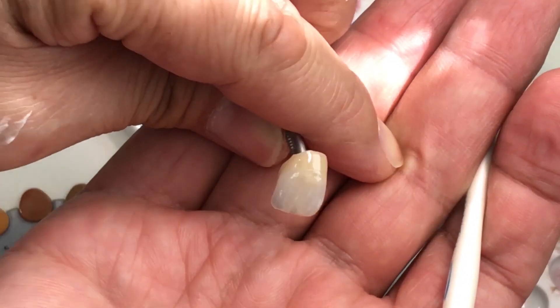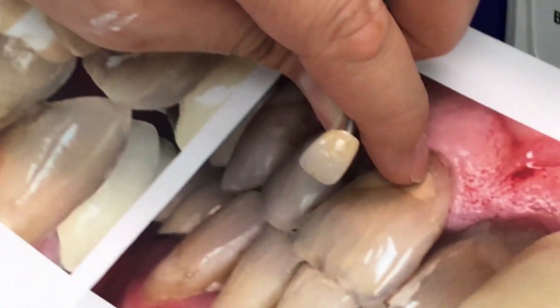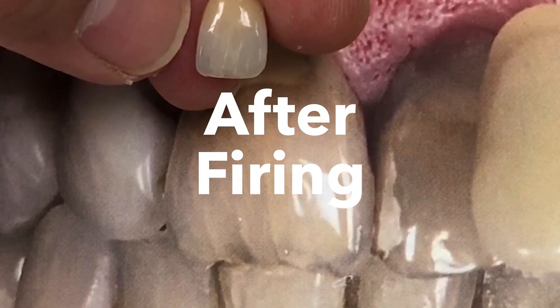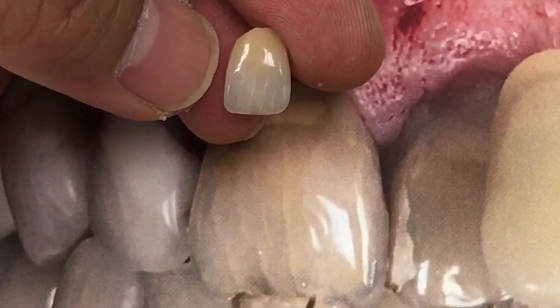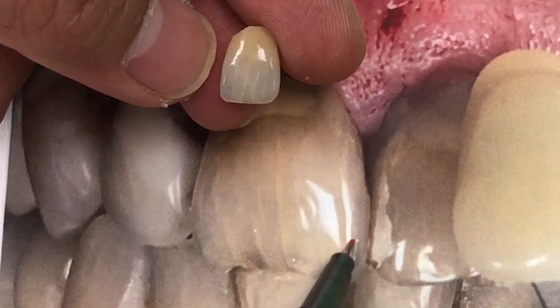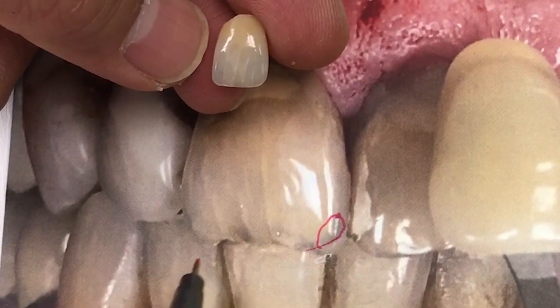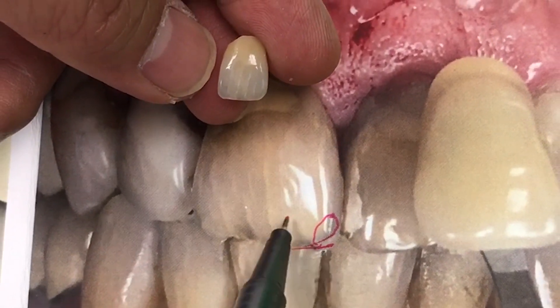Then we just maximize the color here. This is maximized. Like I said, here is the dark between the tooth, and it has a little bit of blue-dark blue. Then between here it has a halo, and between those the color is slightly different.